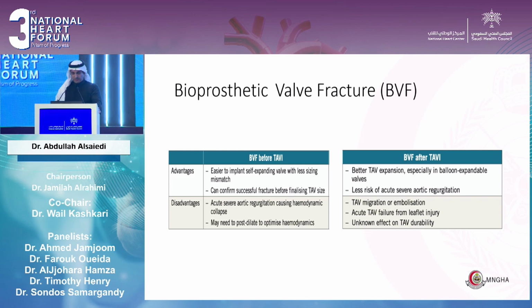The disadvantage is basically having acute severe AI causing hemodynamic collapse. This is why most operators usually avoid pre-TAVI balloon fracture, prosthetic valve fracture. Sometimes we need to post-dilate to optimize hemodynamics in those patients.